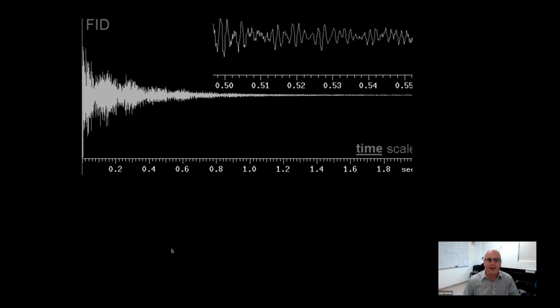So when we get this signal, it is going to be a very complex signal that comes from millions and millions of different water molecules and millions of neurons. It's going to be very complex if we plot it over time. We can see that it decreases over time. That's interesting. But if we look at the frequency content of this, it's extremely complicated to wrap your head around.